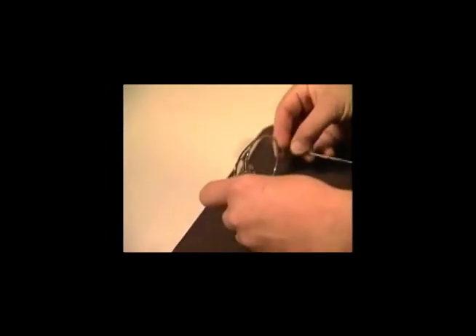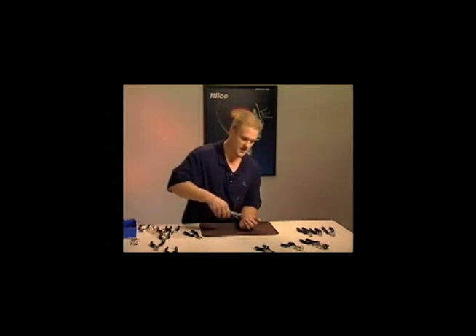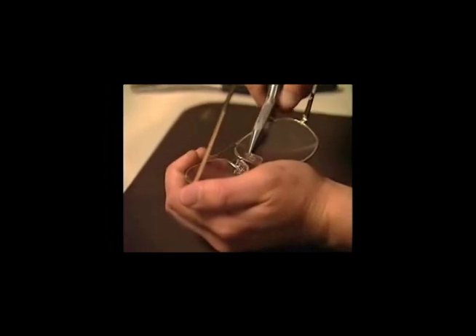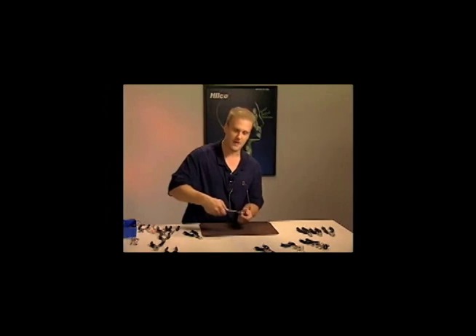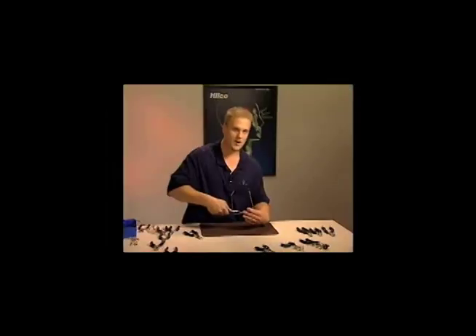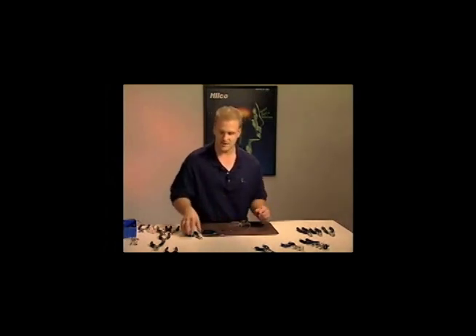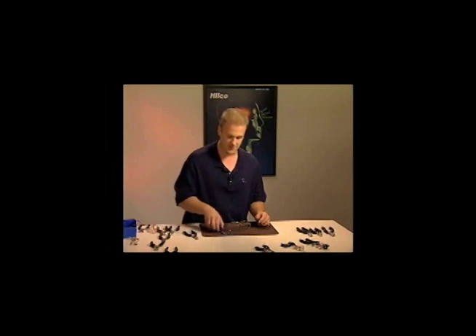Another plier you can use to adjust the guard arms up or down is the snipe nose — some opticians use this, but I really don't recommend it. I definitely recommend using the plier designed for that specific task. If you use the snipe nose to get into the guard arm to change height, you risk flaking the plating of the frame as well as marking the guard arm. If you're working on a very expensive frame, you want to be very careful not to mark it in any way. I recommend using the pad arm adjusting plier — the plier designed for that specific task.